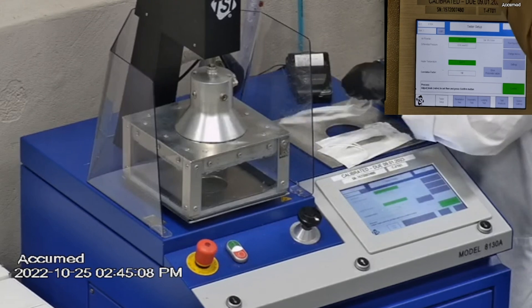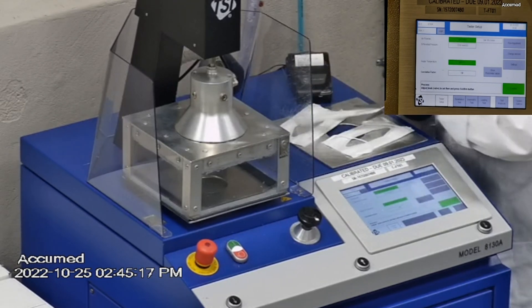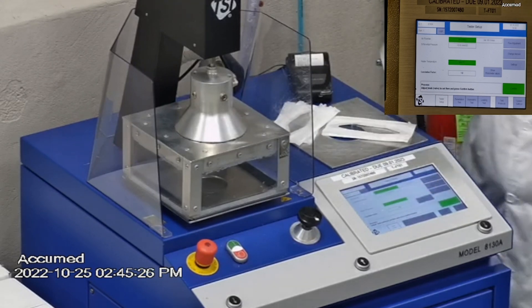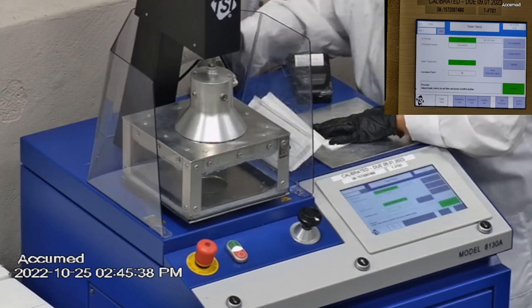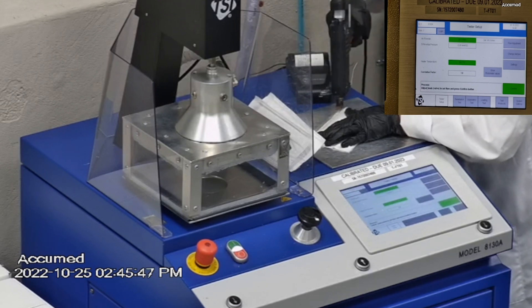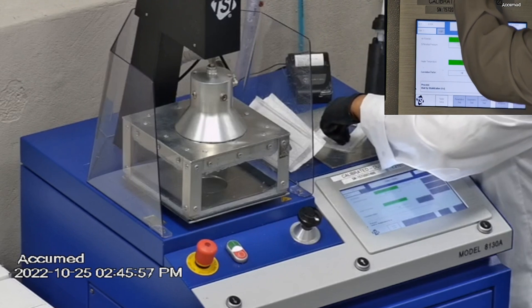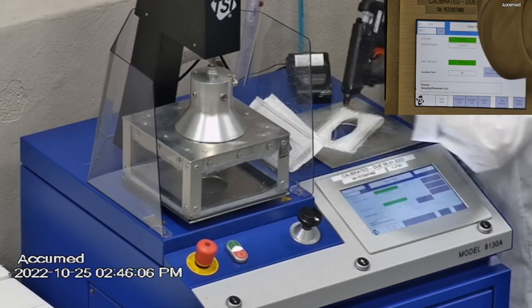The 8130A is the same filtration testing machine that NIOSH uses to approve N95 respirators. Our procedure is also inspired by NIOSH. We first run a tester setup and start removing the headband from the respirator before placing it onto the testing plate to ensure a proper seal. Then we make sure that the mask is properly and completely sealed with hot glue to the testing plate. When applying the hot melt glue we make sure that there are no holes or leakage around the seal to ensure accurate results. The testing plate is then attached to the frame and the box is placed under the TSI filter holder for testing.